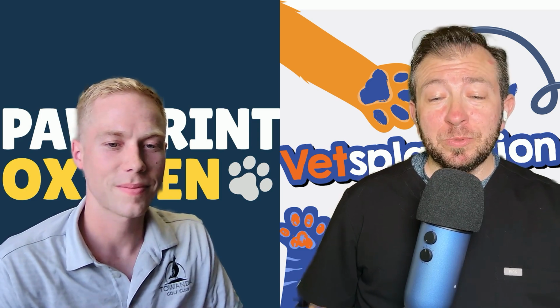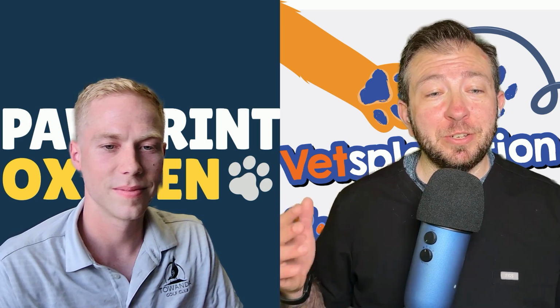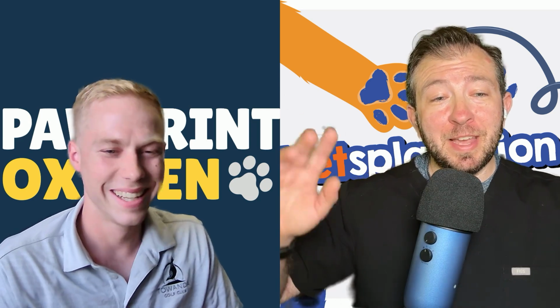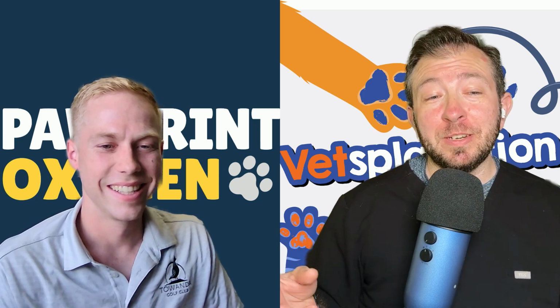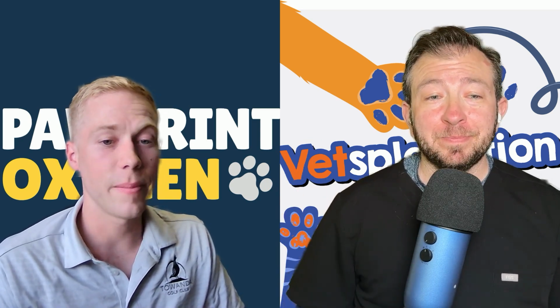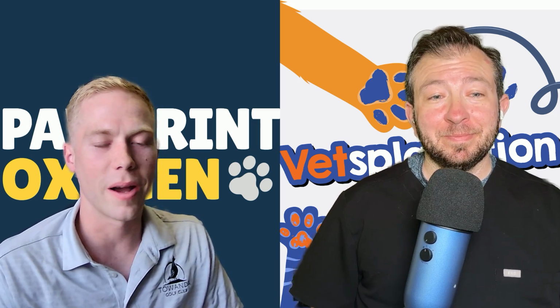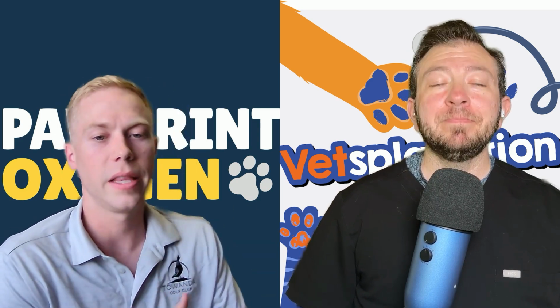Yeah, a long, long time ago when I was a technician, we didn't really have oxygen cages, and we would just put Saran wrap around the cage doors. But that was terrible, because one, we couldn't get a lot of oxygen in, but two, it also heated up that metal cage so quickly. It's amazing to see how hot it will get in there without the proper oxygen flow rate. We even had ice packs you could put in, things like that.